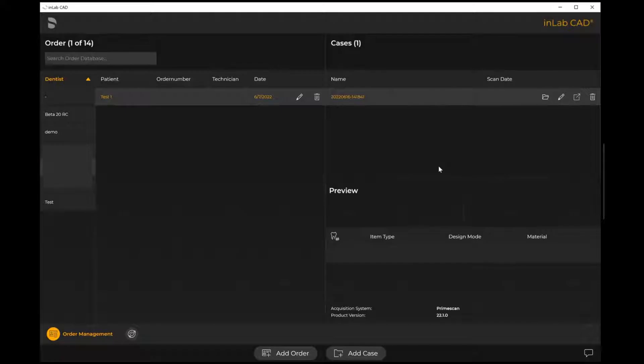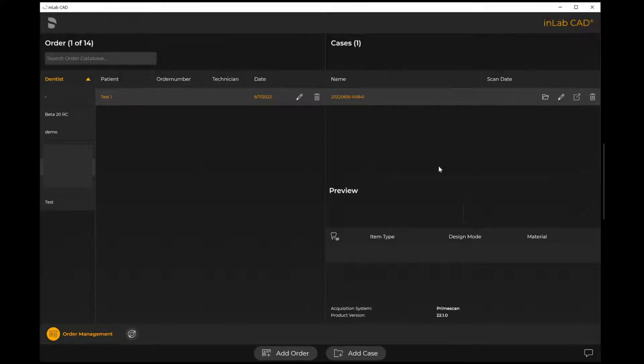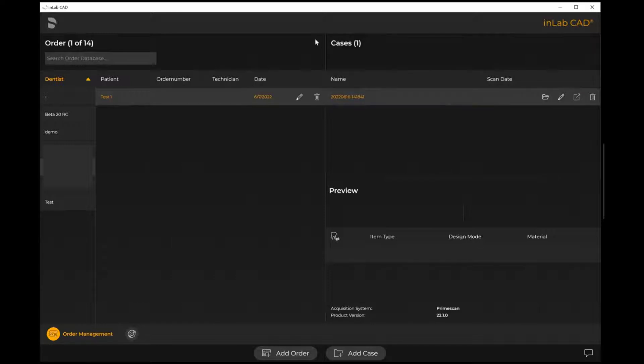Hello and welcome. Today we are going to take a look at the workflow for how to download a file from the Connect Case Center portal as you are logged into your inLabCAD22 software. When you first open up the inLabCAD software 22, your home screen is what's known as order management.